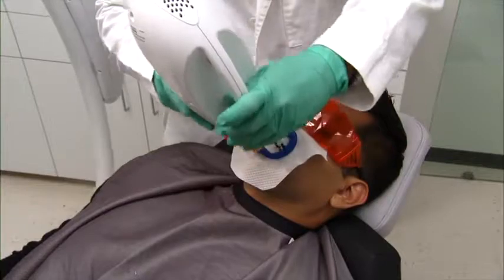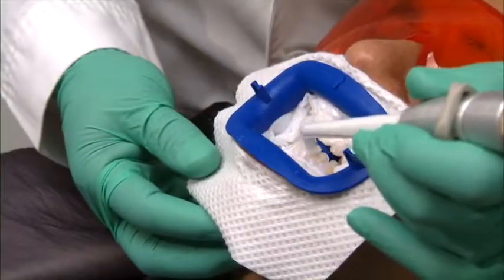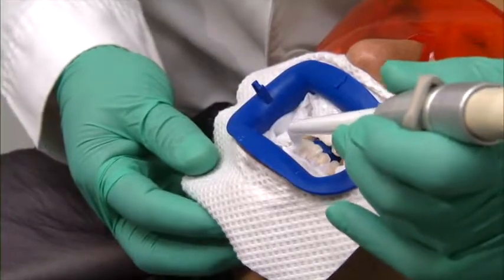Section 7. Isolation Removal. Remove the light guide from the slots and gently slide the lamp out of the way. Use the surgical suction tip to remove gel from the teeth.